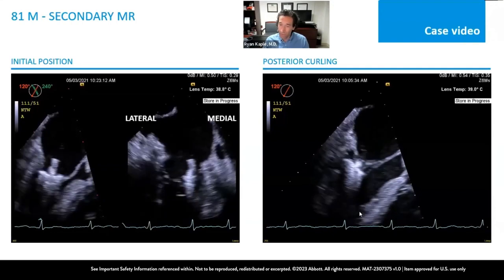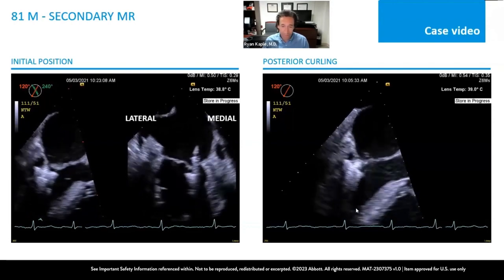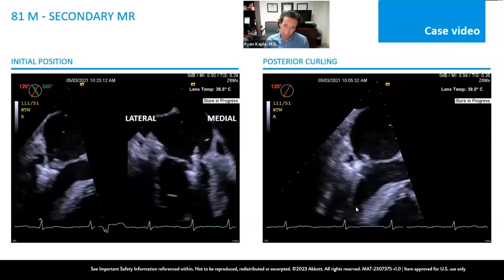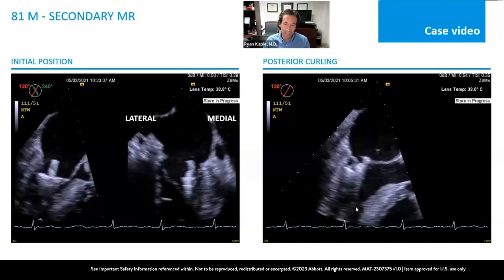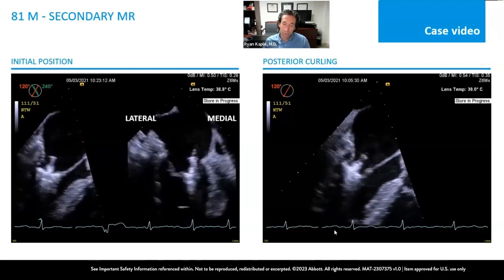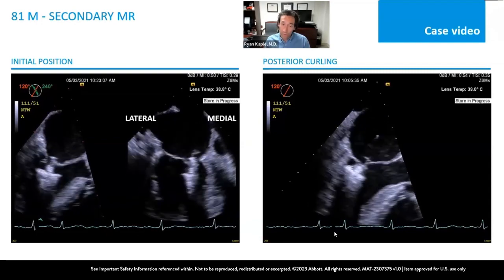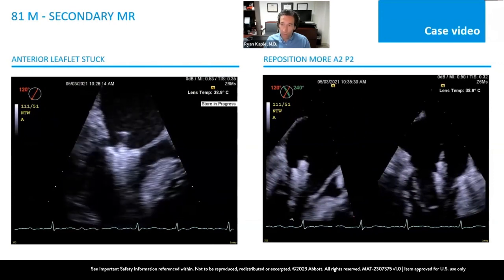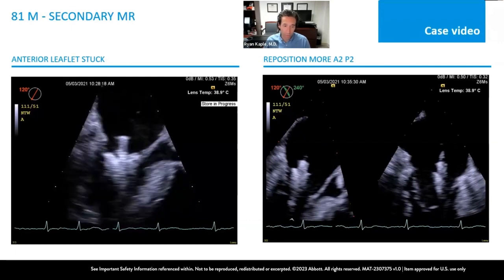And what that means most likely, and it's hard to say for sure, but what we all hypothesize, is that one of the cords that is tethering is interfacing with the tip of the arm, so it's just not falling down into that V between the shaft and the arm. So oftentimes you do need to move the clip one way or the other. Because we were already biased quite towards the commissure, we decided to move a little bit more central and try to get away from that cord that was causing us problems on the posterior side.